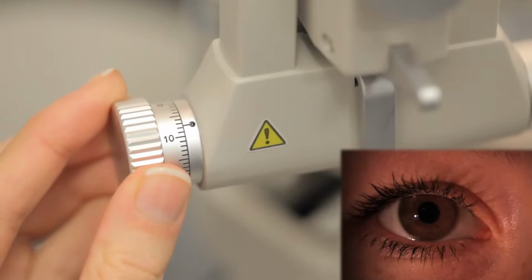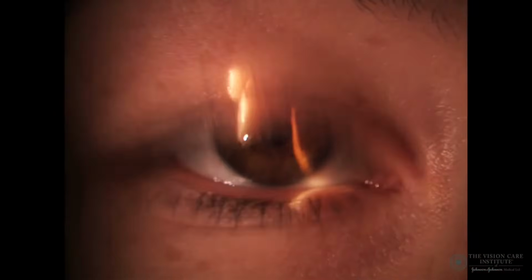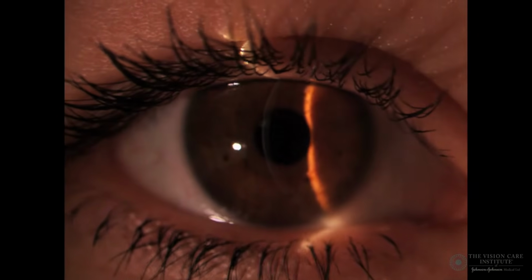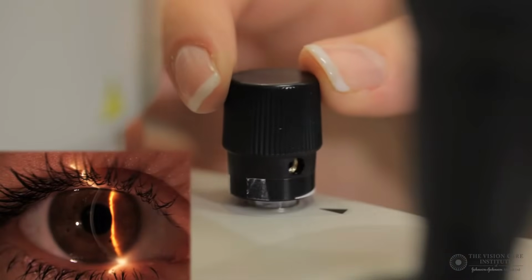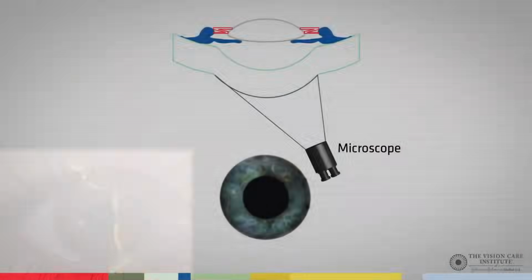patient's eyes. To begin with, we want to thin the slit down as much as we possibly can, which will allow us to get good resolution of the section. Focusing might be helped by increasing the magnification. Here we have the section fairly clearly in focus, and because we have the slit very thin, we can increase the brightness as much as we can.